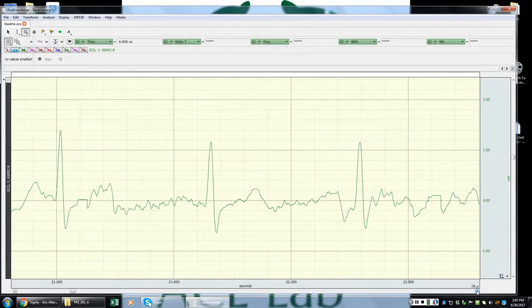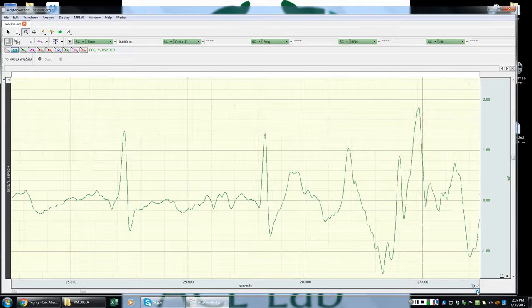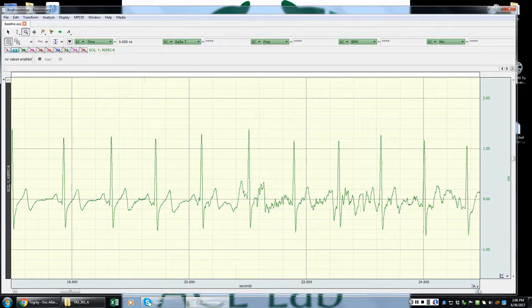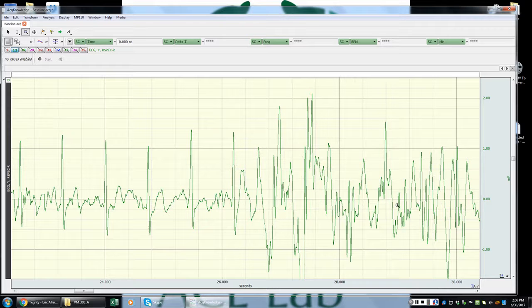All right, so let's continue on here. And again, these peaks look pretty solid. Okay, so now you can see things are getting a little hairy. All right, so if I zoom out for just a second, you'll notice we have a very large kind of mess of waves here. Now, at first glance, this looks pretty ominous and difficult to reconcile, but you'd be surprised, there's actually ways for us to go through here and identify what truly are the R peaks that we should see within this sample.